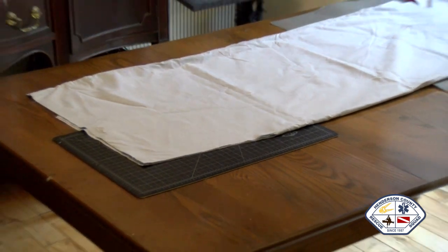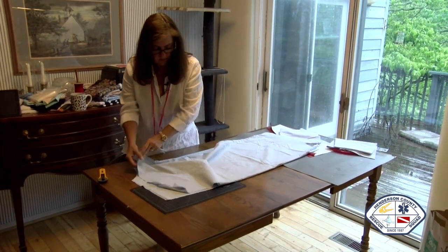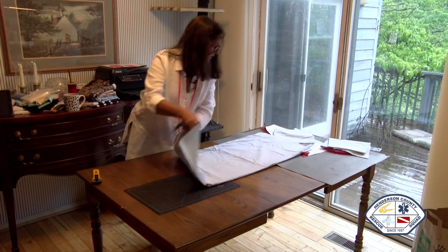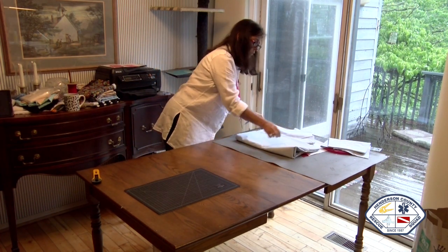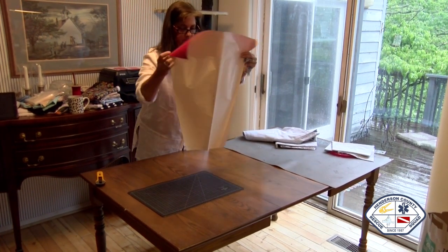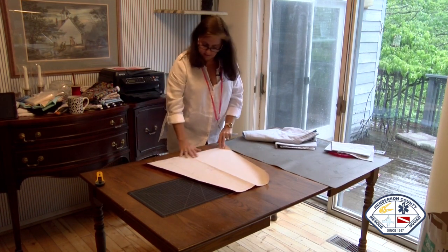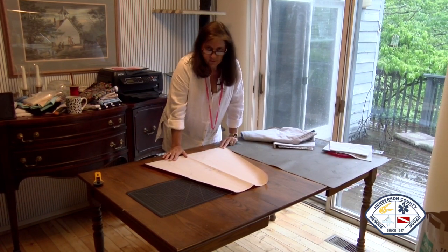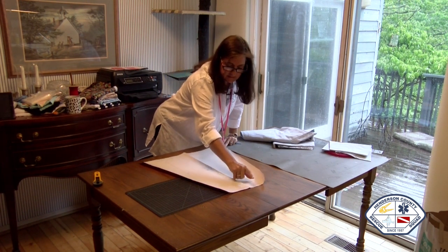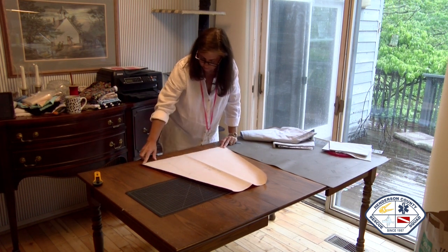In addition to the body of the gown, we also obviously have to have a sleeve. So with another part of your pattern, we have cut out a sleeve. 24 inches long, 24 inches wide, and 11 inches. This is going to be your wrist of your sleeve. This is going to be your shoulder.